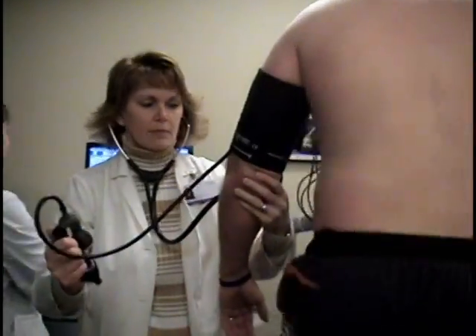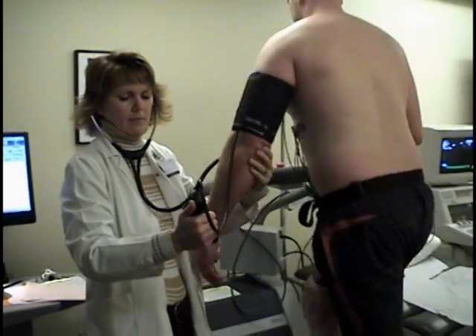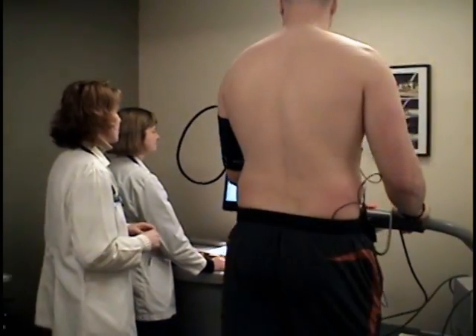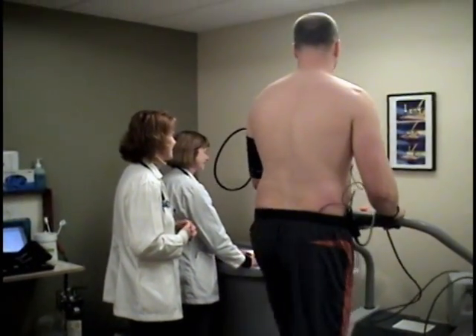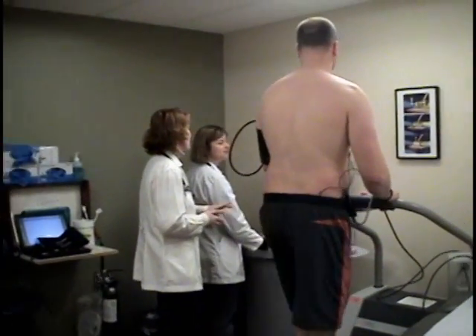We will continue to monitor your vitals to ensure your safety. After you have reached your target heart rate, we will begin the cool down portion of the test. We will continue to monitor your heart rate for at least 8 minutes.